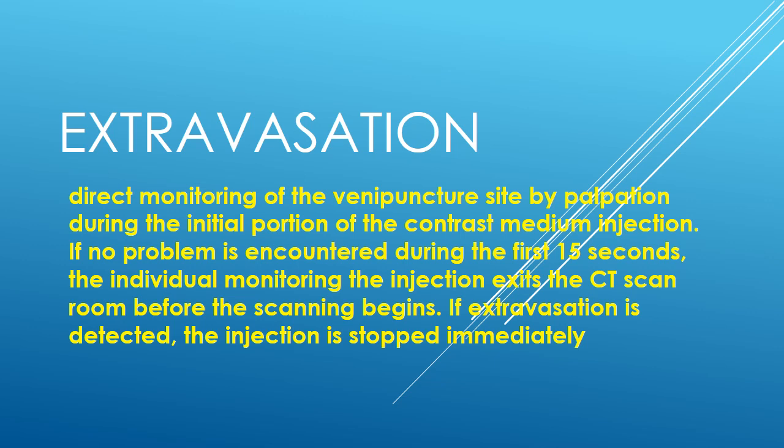So here my suggestion is, if you are giving a contrast injection by pressure injector, you wait for the first 15 seconds next to the patient to see whether there is an extravasation or not. If there is no extravasation, then you leave after 15 seconds.